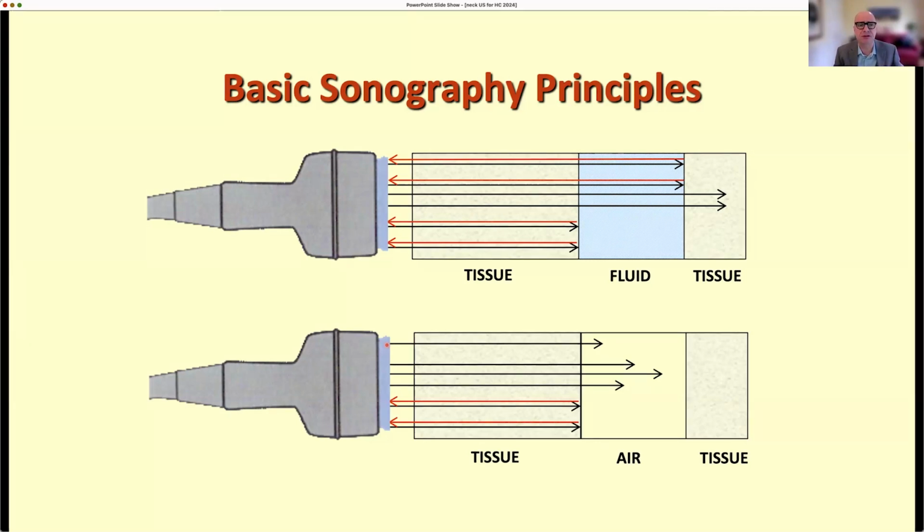So here, this diagram shows on the top how the probe generates an ultrasound. And the way the ultrasound works is that an ultrasound is reflected back to the probe each time it hits an interface. An interface is a change in phase in the matter that the ultrasound is crossing. So for example, here we have solid tissue, nothing gets reflected because it's homogeneous. Then it hits fluid, and all of a sudden the phase is changing, ultrasounds are being sent back, the crystals are excited, and they will generate electrical signals, and you'll get the picture design.